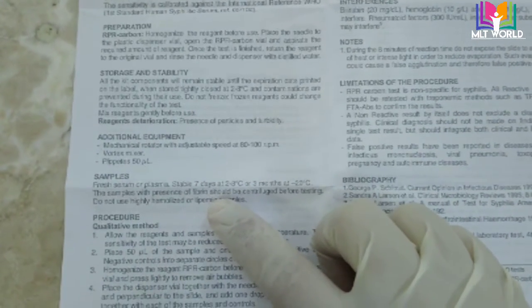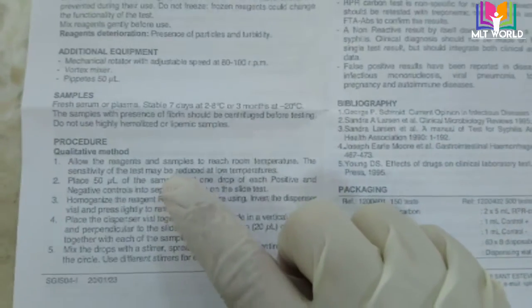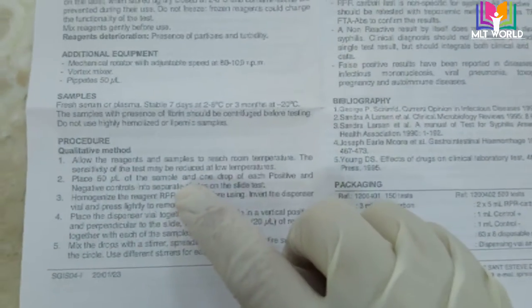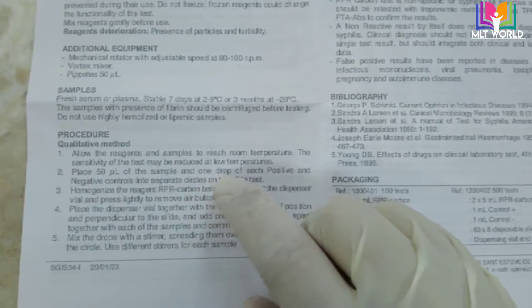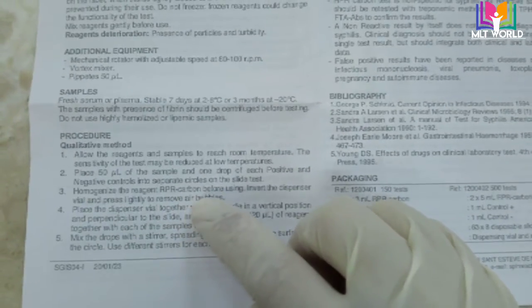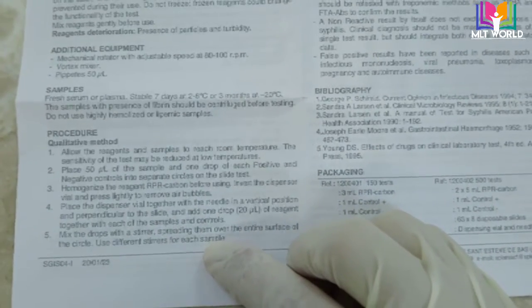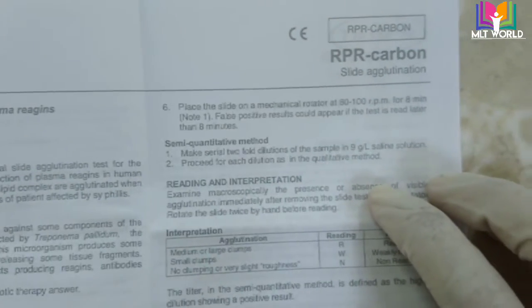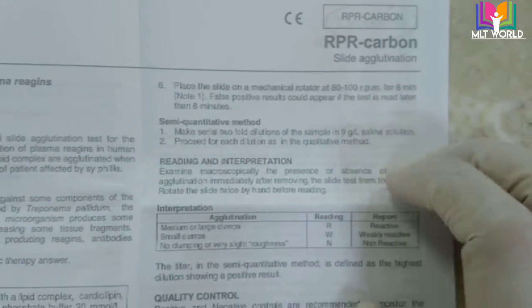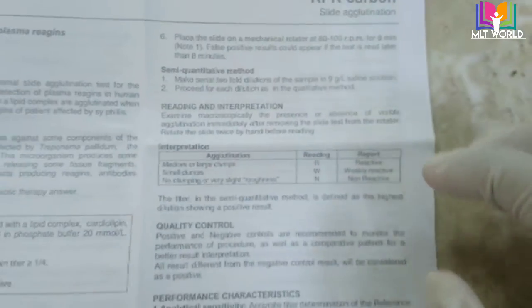After studying the principle, check what sample types are required to perform this test — whole blood, serum, plasma, or another type. If performing the test the same day, the sample should be kept at room temperature. If performing it the next day or after one week, the sample should be kept in the freezer or fridge.